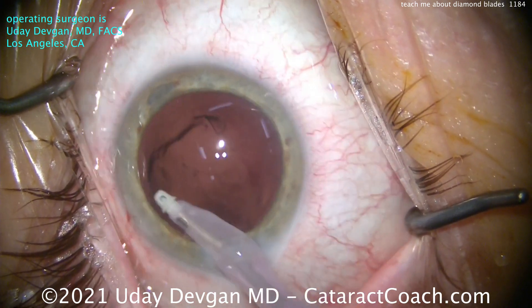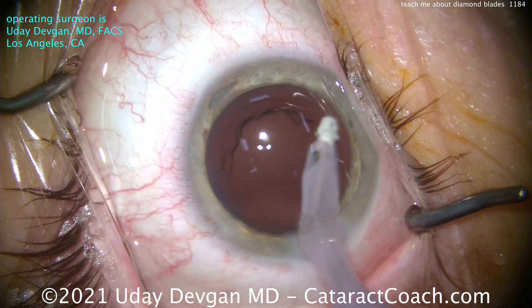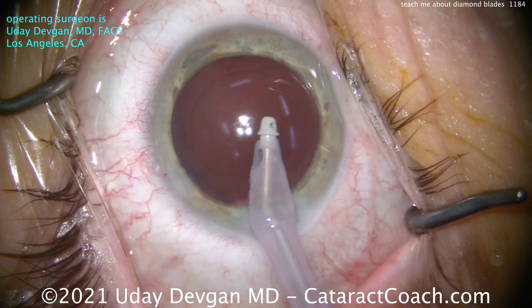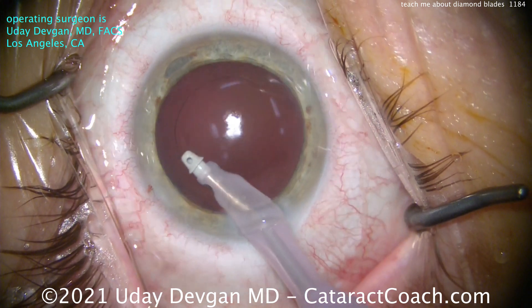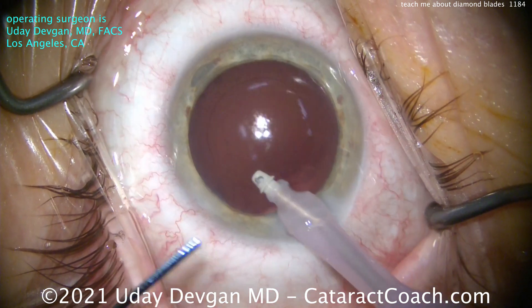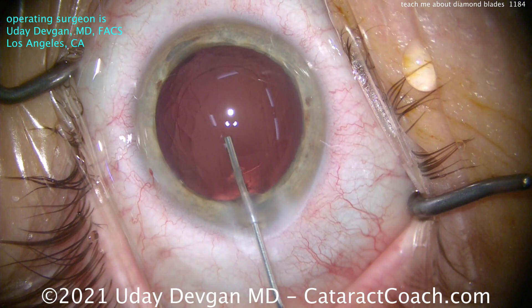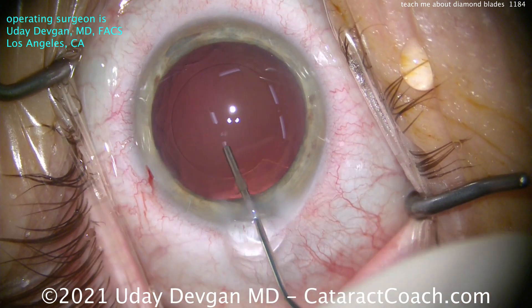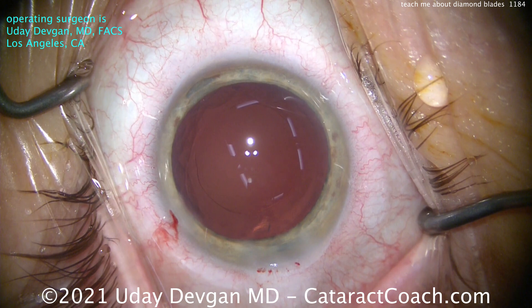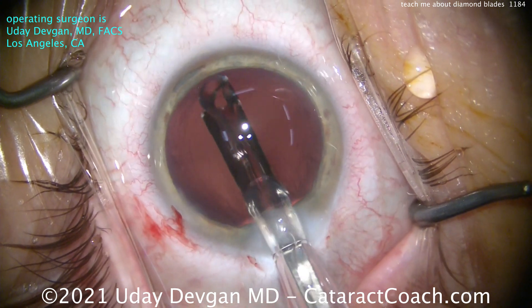I certainly can use a steel keratome, and you've seen many videos of me doing that in other locations. But in Beverly Hills, it's only diamond keratome. The femtosecond laser can make a reasonable incision, but it's not nearly as good as what you can make with a diamond keratome. This is why most surgeons who use a femtosecond laser for cataract surgery don't use that laser to make the incisions — because it's just not as good as a steel keratome, and not even close to being as good as a diamond keratome.